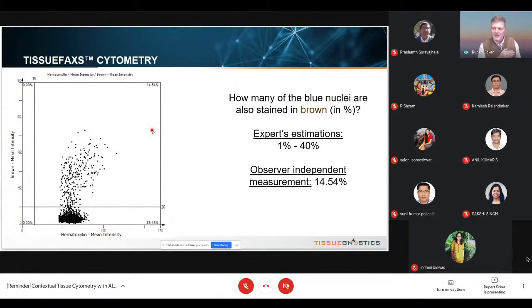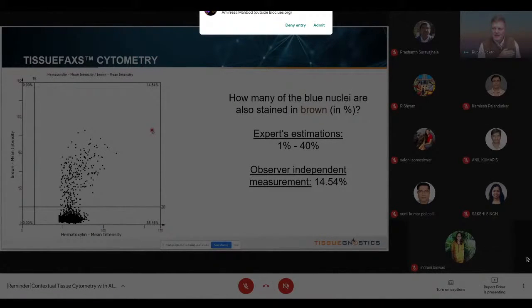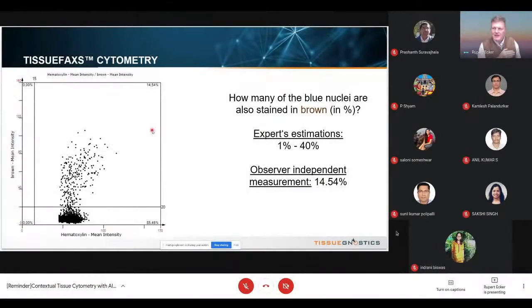So you have to use a separate tissue section where you apply an isotype antibody and you acquire under the same conditions like your test samples. And based on this isotype, you set your cutoff and then apply the same settings to your samples under investigation. Then you can compare the results. And this way, you have an observer independent and quantitative result on the single cell basis.